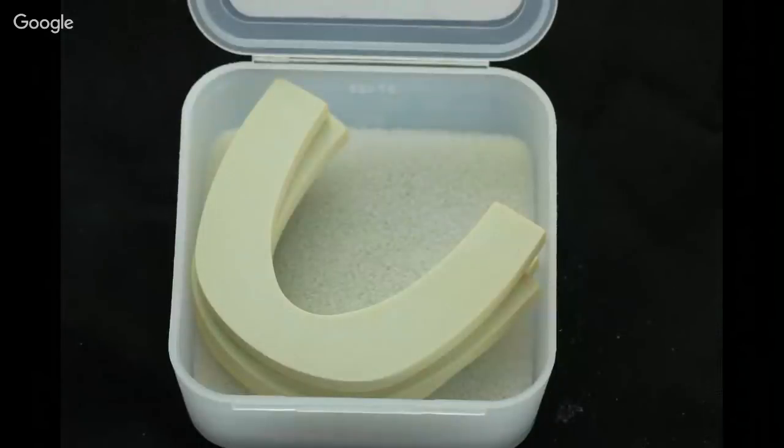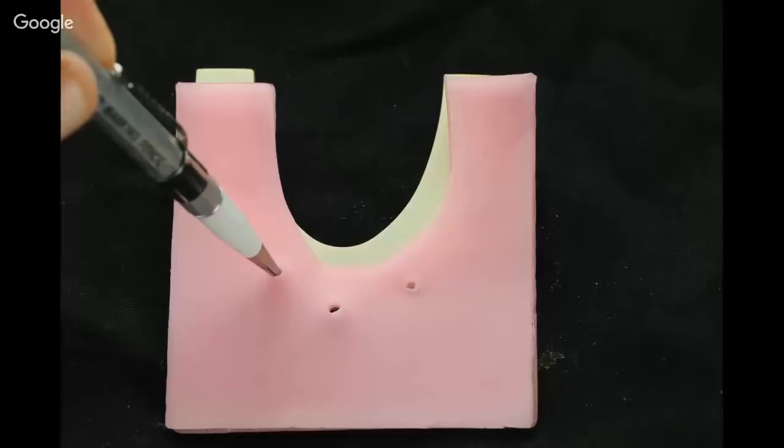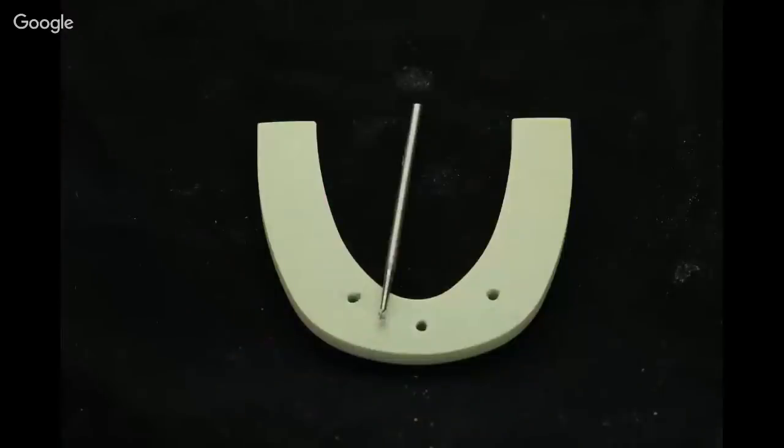It comes in 3, 5, and 7 millimeter thicknesses, and they're just shaped to these horseshoe shapes, kind of like an arch would be. So what I can do is, here I've taken out a 3 millimeter thickness of this, and that little template I just made by pressing on the cylinders, I lay that onto the arch bar, I stick the pencil through it, and I'll mark those cylinder positions. Here they are.